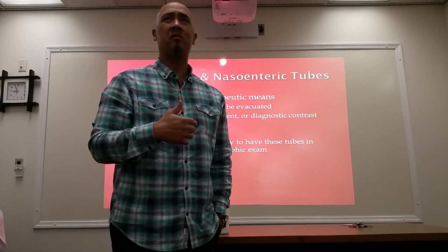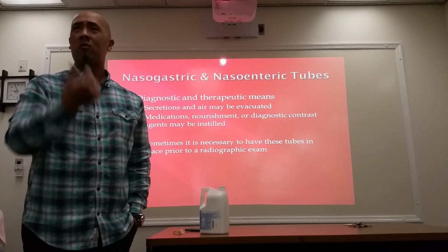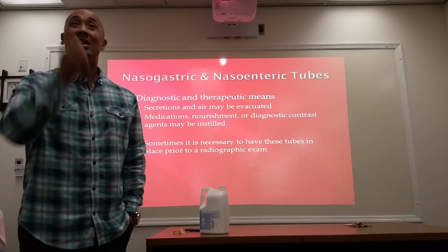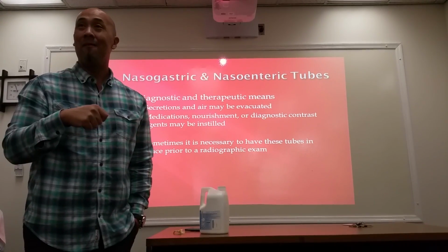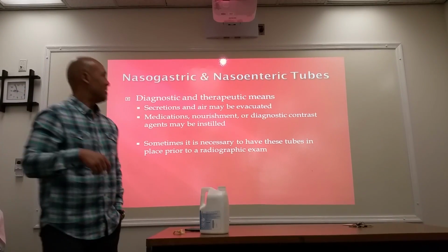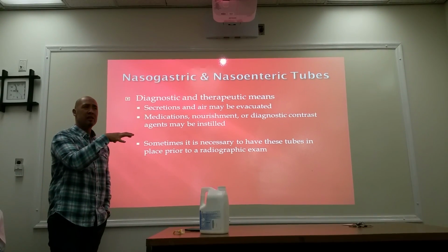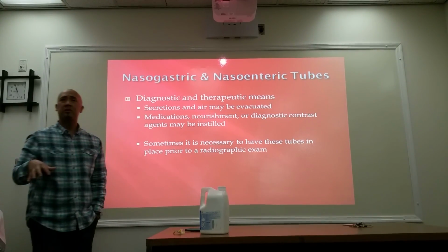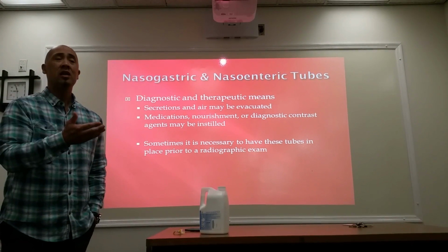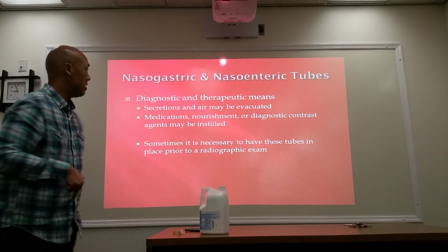They're awake when they're doing this, okay? So they're swallowing for us. So they're awake, we're putting the tube down, they're swallowing, they're gagging, and they're trying to swallow and they're gagging. You keep trying to push that thing down their throat. Should it be lubricated? Yeah, it should be lubricated, be nice. It's done usually in their rooms but we can also do this in radiology with the assistance of using fluoroscopy to see it and guide the catheter down.